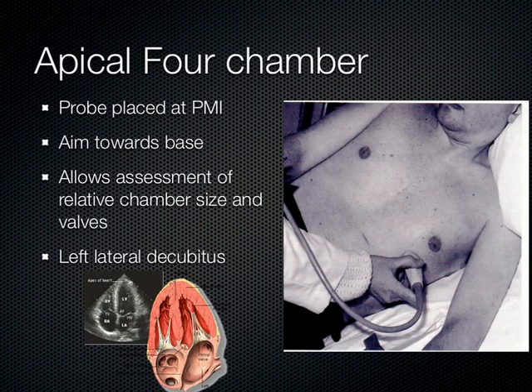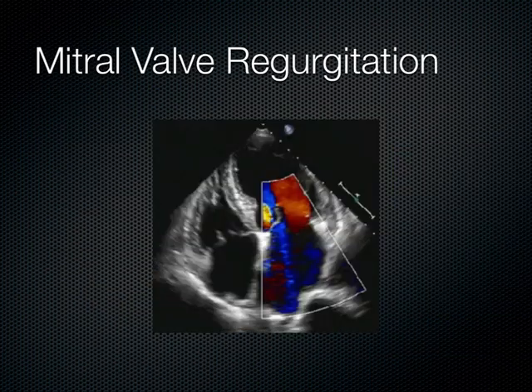The apical 4 chamber is obtained by putting the indicator to the patient's right, and you're really going for that PMI — that place on the chest where the apex of the heart comes to the chest wall. This is made easier when you put the patient in left lateral decubitus, as you're about to see.